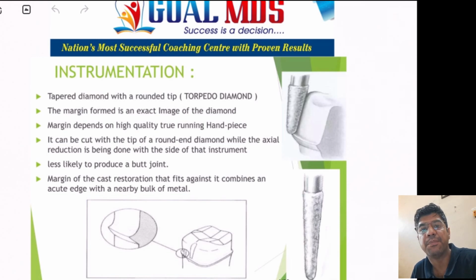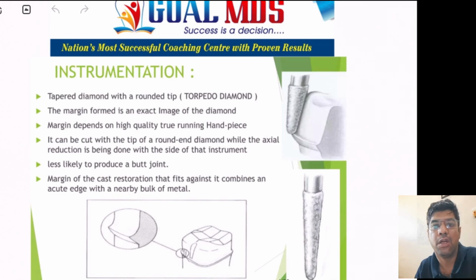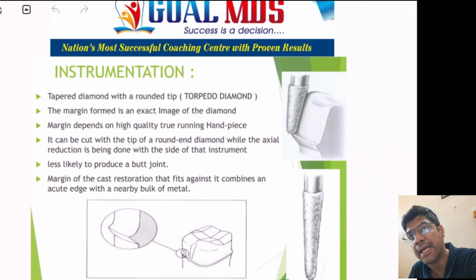Second, the cast metal restoration requires a strong retention. As we know, cast metal restorations, due to the high biting forces they encounter, need a strong retention. So the chamfer finish line, along with the characteristics of cast metal, offers excellent retention properties. So that will ensure the restoration remains securely in place.